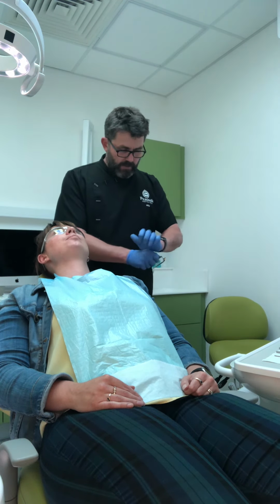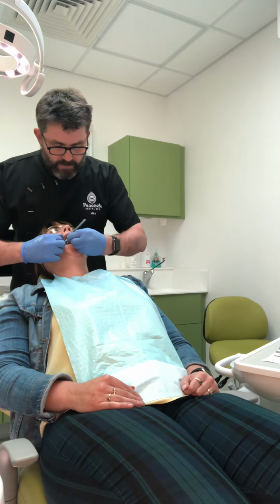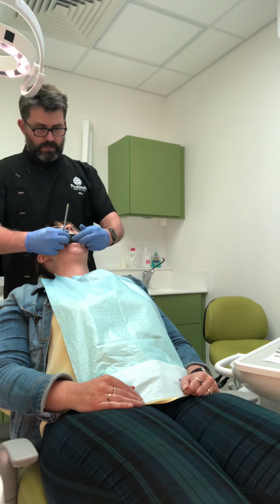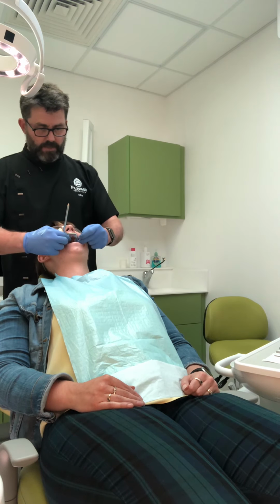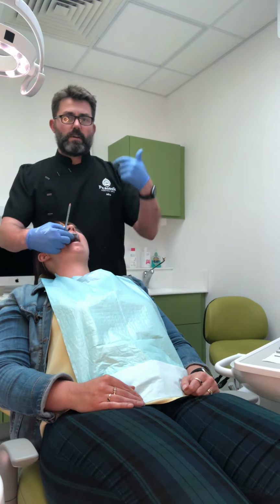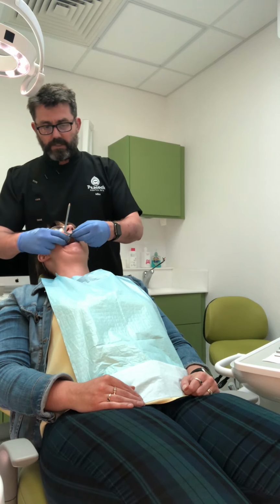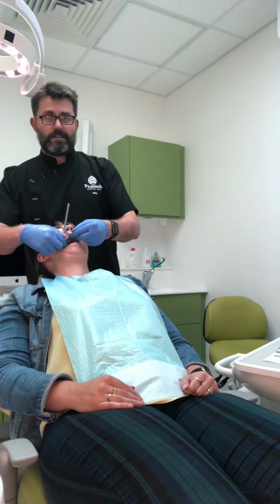And there's a little notch on the top of the bite fork, which I'm going to get straight down the midline of Emma's face. I'm just going to place that up there, like so. So we're not looking at getting between the incisors, just in case there's a shift of the midline. It's straight down the midline of the patient's face. I'm just going to leave that there for a bit. I'm not pushing too hard because I don't want to push through the bite registration material onto the bite fork itself. I want there to be a nice amount of registration material just in case there's any mobility of the teeth. I'm just waiting for that bite reg to set. Shouldn't take too long.